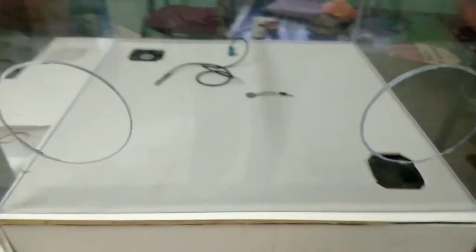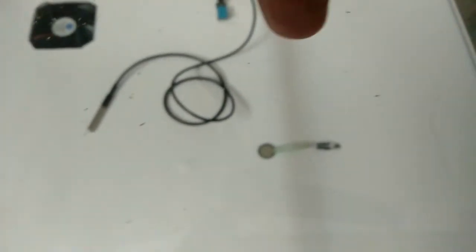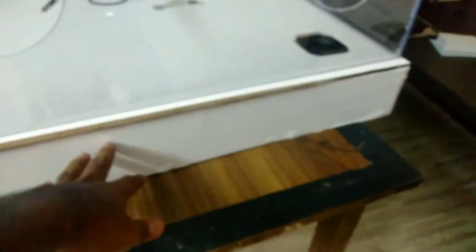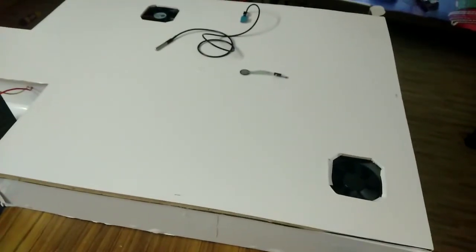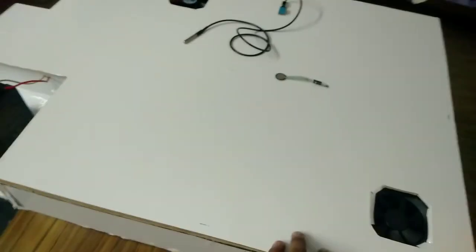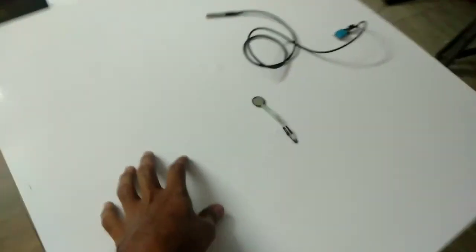So this whole system works on the blow dry principle. There's a fan over here, a fan over here, and a fan at the center of the box. Basically this is a matchbox kind of structure. It is packed for now, so I have to explain it from above itself.